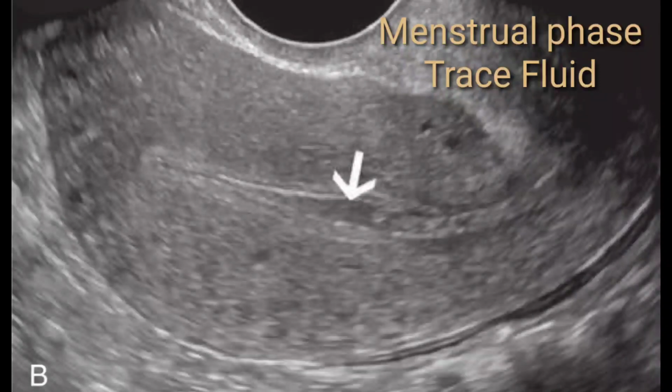Because if you are just mentioning fluid and you are not correlating it with your diagnosis, your colleague, your GP or surgeon or gynecologist may get confused about what it means. Therefore, you have to exclude the pathology. If it is non-pathological, put small fluid, that could be physiological. But if it is pathological, always mention that this is a pathological fluid. This clearly shows you endometrium in the menstrual phase with small fluid collection within the uterine cavity.